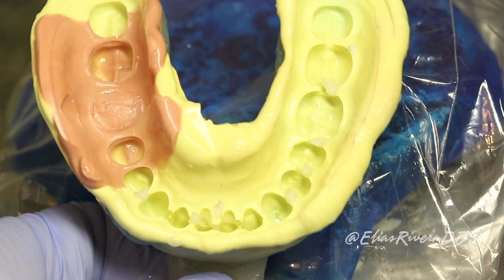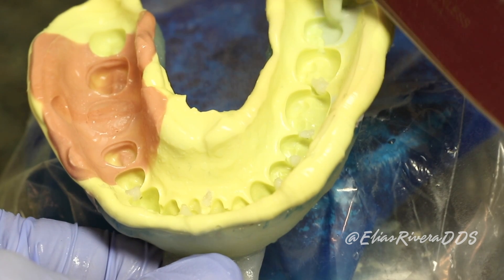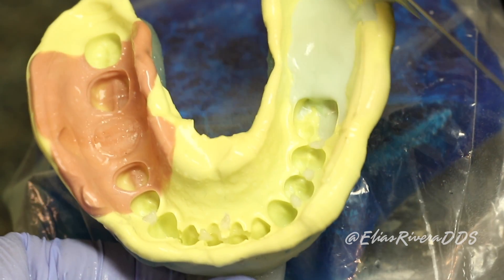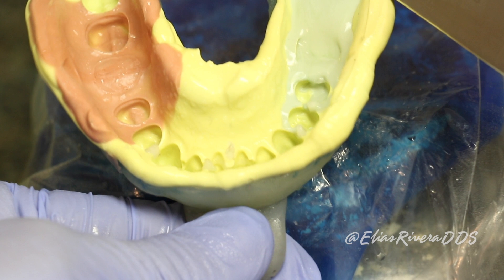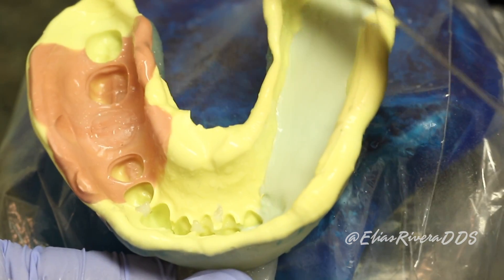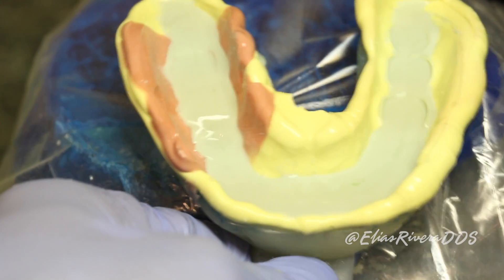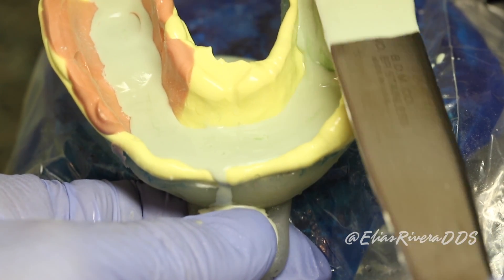The impression is going to be treated with the bubble obliterator to eliminate the surface tension. We're going to eliminate the excess and then we're ready to pour. We're going to apply the stone from one side and let it flow to the other side. Once we have this first layer poured, we're going to start adding stone to get around 13 to 15 millimeters in excess over the tray.